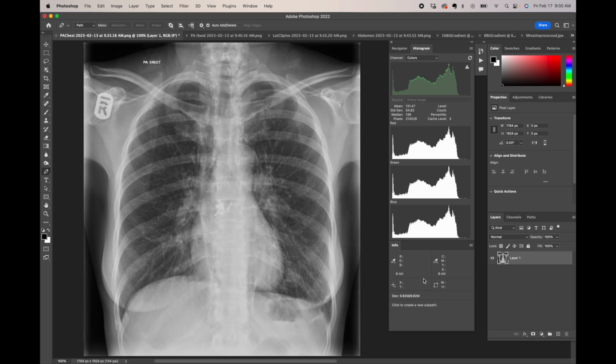And the same thing goes with images. When you start seeing those numerical values where they're not equal, that represents some shade of color, some visible color that we see on the screen in front of us. Since this is a grayscale or black and white image, those numerical values will all be the same.